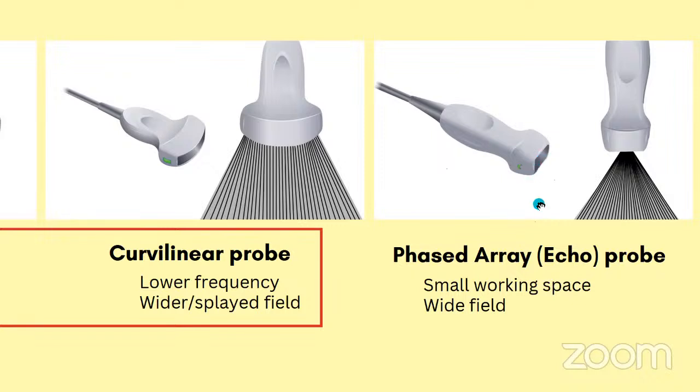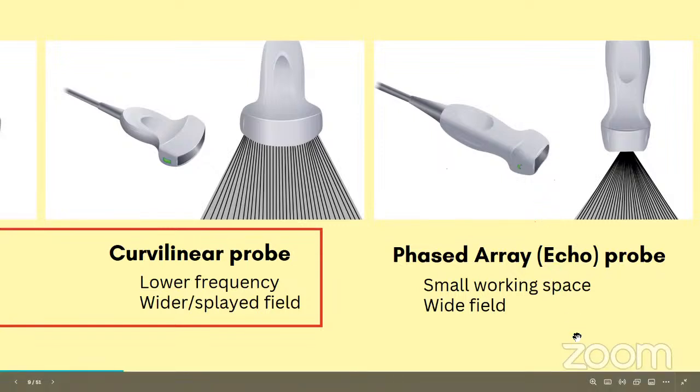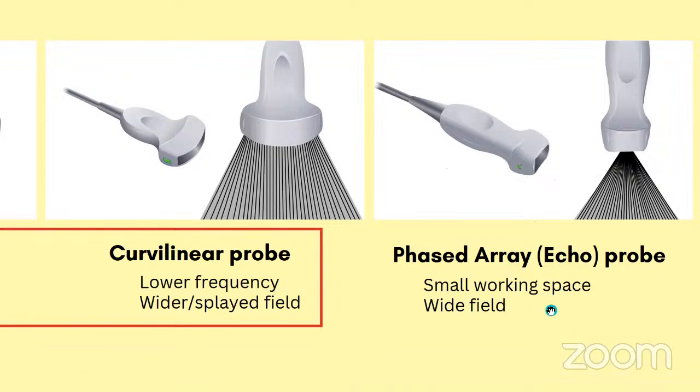So this would be much easier to use in the case of tiny nooks and crannies. Since we are getting the term echo, which is echocardiography for short, the heart is completely surrounded by lungs as well as ribs. So it is really hard to see the heart, since before getting towards the heart, the ultrasound pulses would just die off because we have multiple organs completely surrounding and protecting the heart.